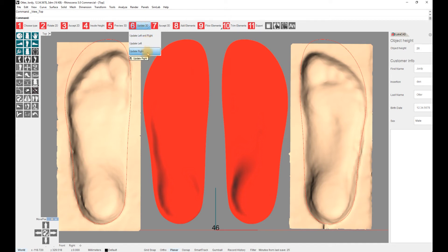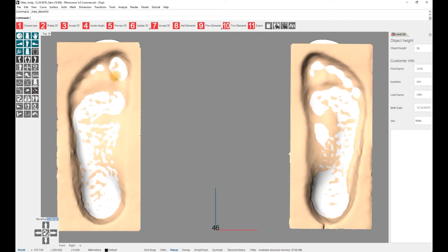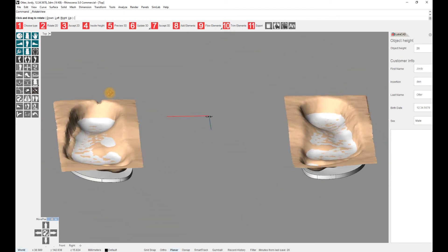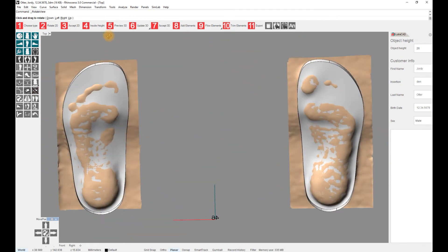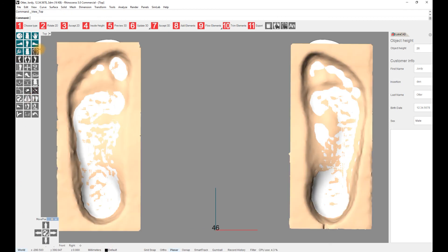When the insole is correct, select step 7, accept 3D. The preview will be gone, and the insoles will turn white. You can check your full contact insole by selecting Show Mesh with the left mouse button, which will make your 3D scans reappear. They can be hidden by using the right mouse button and selecting Show Mesh again.